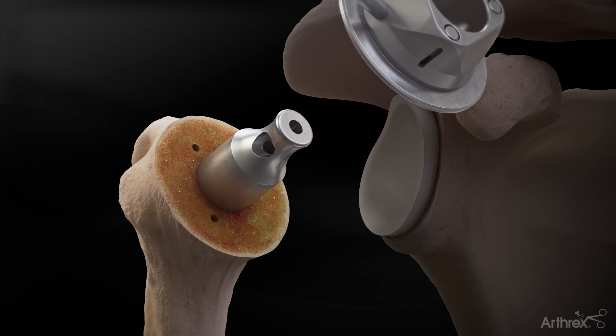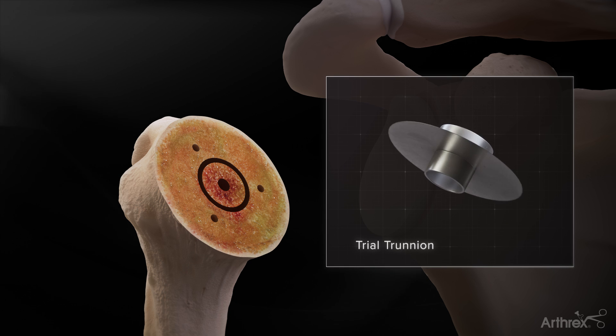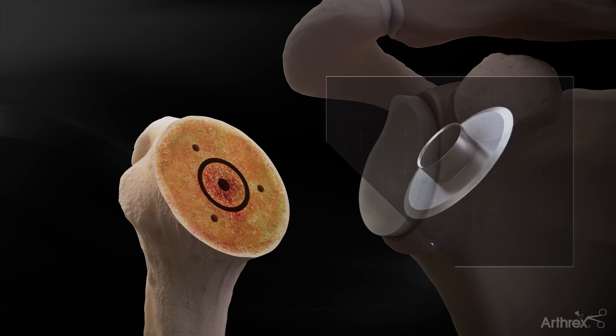Remove the coring template. If desired, remove the centering device and use trials to verify the trunnion size, humeral head diameter, and thickness.